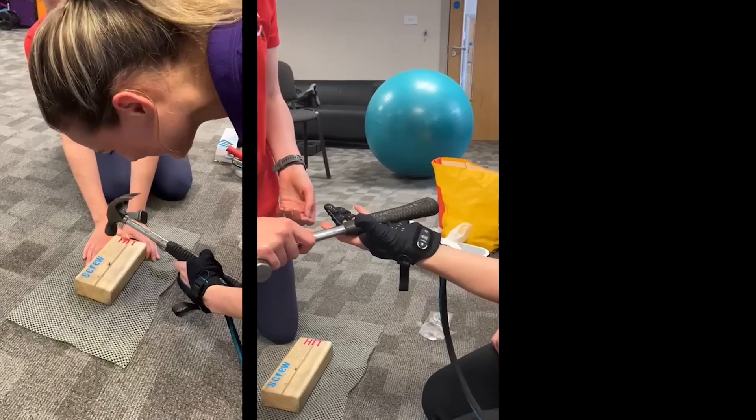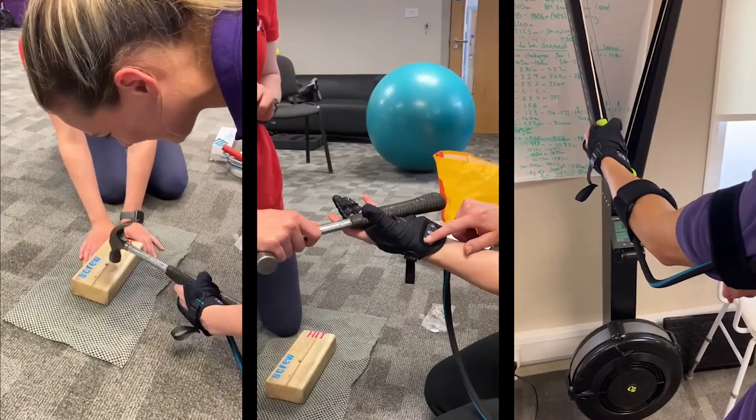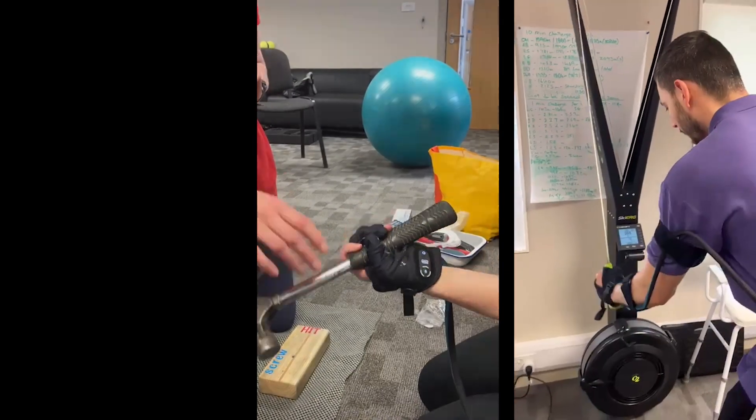This is the Carbon Hand. It is made by BioServo in Sweden and is for anybody with impaired hand function and weak grip. Carolyn Jones from Anatomical Concepts gives NR Times a run-through of how Carbon Hand works as an assistive device.